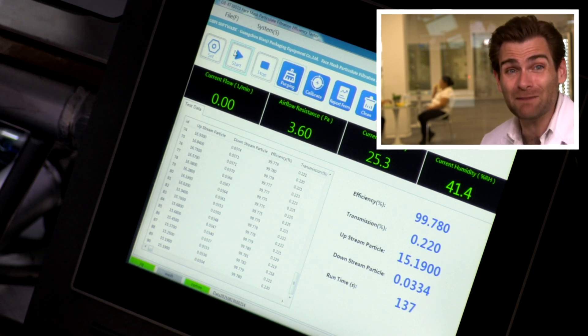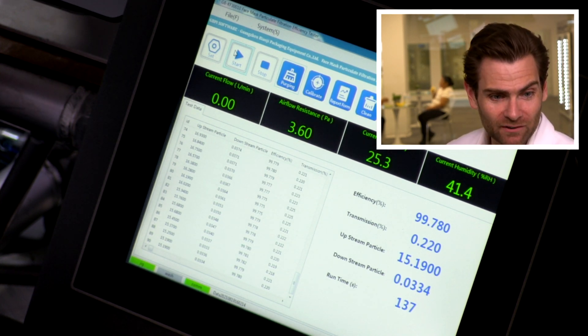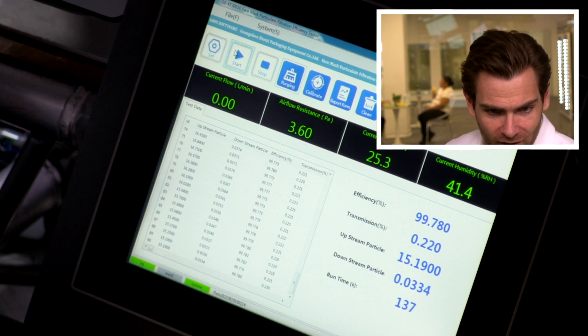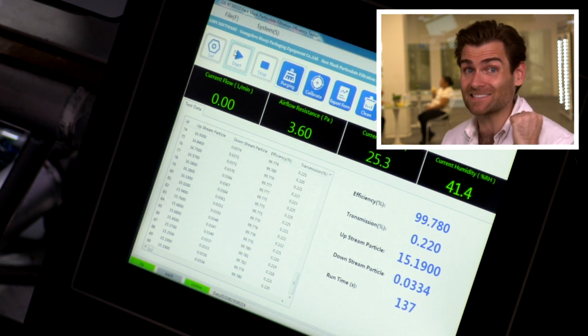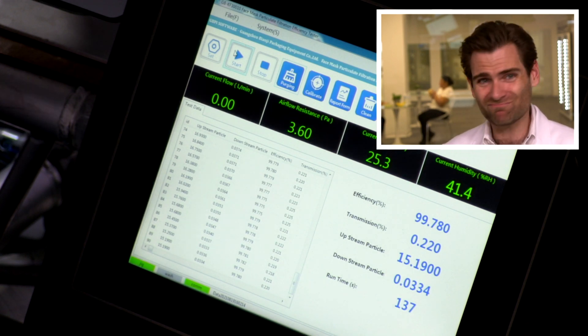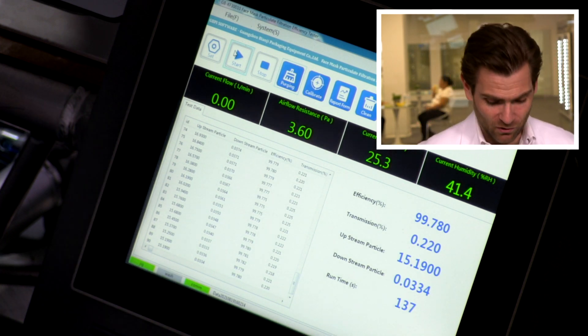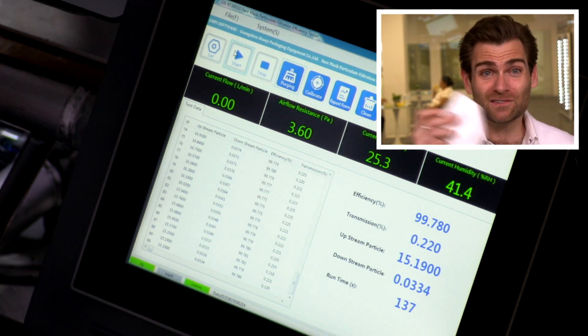But does any of that subjective stuff matter if it doesn't protect you? Let's check out the PFE machine. 99.78. Wow — 99.78. That's the best score we've gotten so far. Nice job. Super breathable. Top scores. Fits in your purse with a Ziploc bag. Hard to go wrong. Nice job, Demotech. You get the gold star for being one of the better ones.